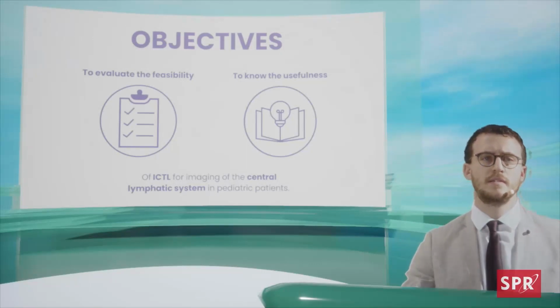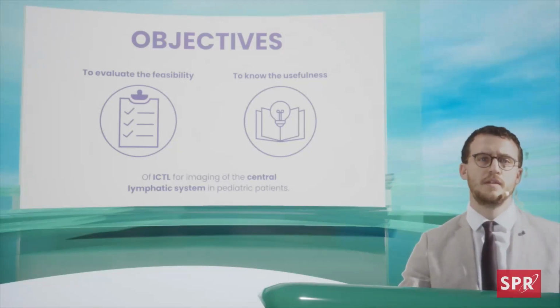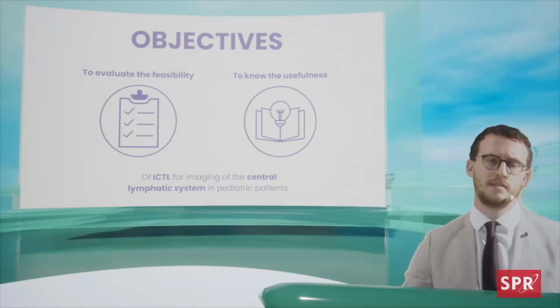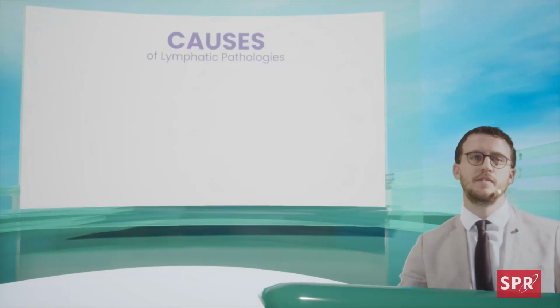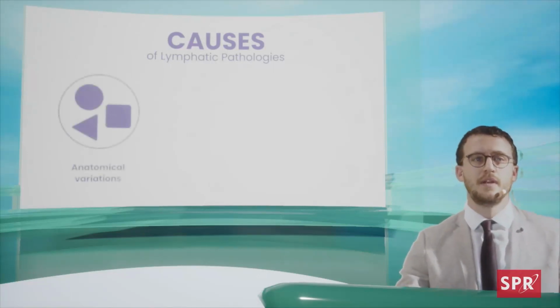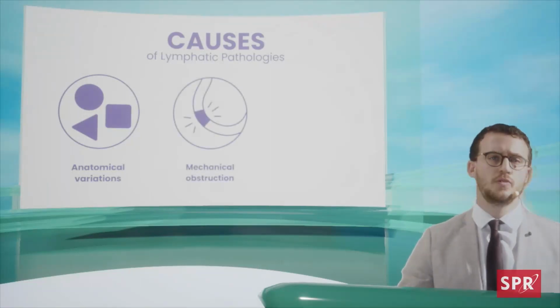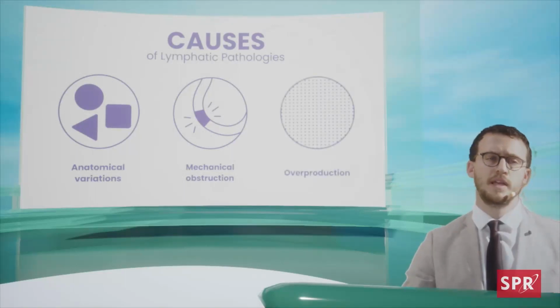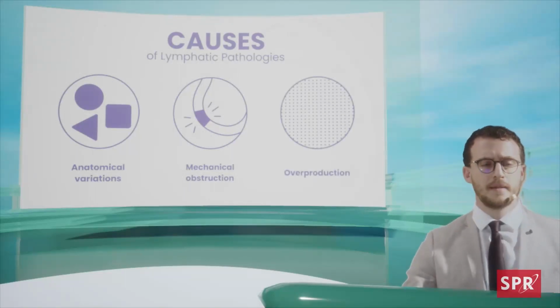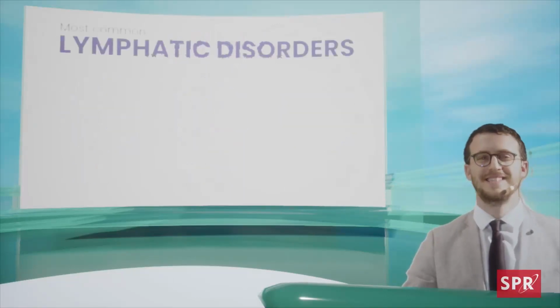So we thought as a team, why not try an intranodal CT lymphangiography for our patients with lymphatic system disorders, of which there are lots? What are the causes of the lymphatic pathologies? We know there are anatomical variations that can cause lots of lymphatic pathologies. We've seen mechanical obstructions, tumors, for example, that can cause lymphatic disorders, and mainly overproduction. We're not going to talk about this because then the lecture will be really long.